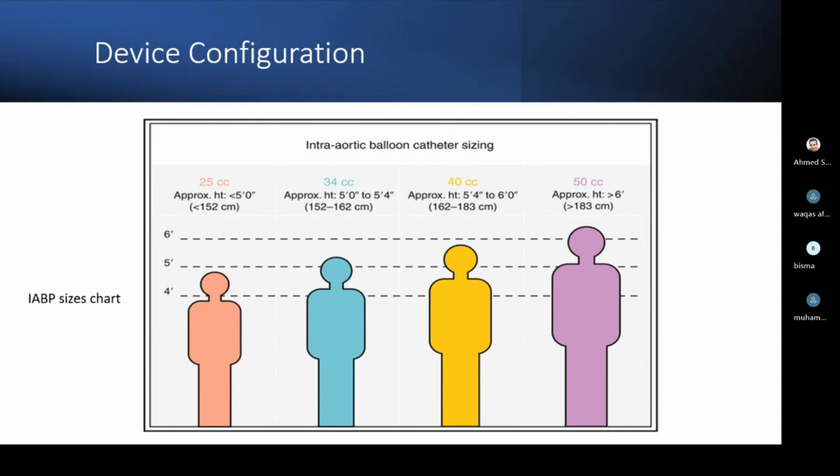Both will achieve the same occlusivity, but one will be longer, the other one shorter. 8FR 50cc and 7FR 40cc are almost the same. So I will prefer the longer one, I think, if both are the same. It also depends upon the height of the patient. Both can do the same job, but definitely there are other parameters also, not only the height.